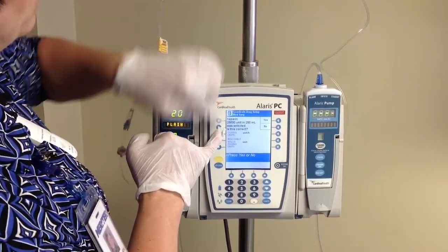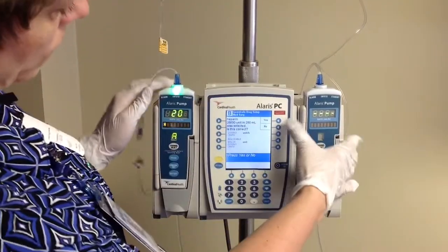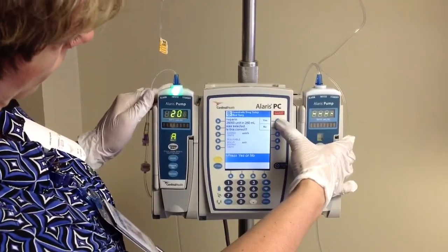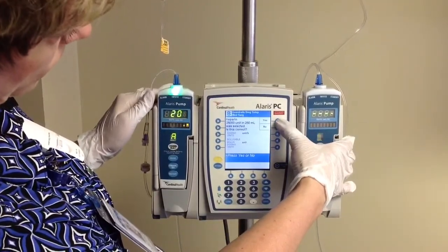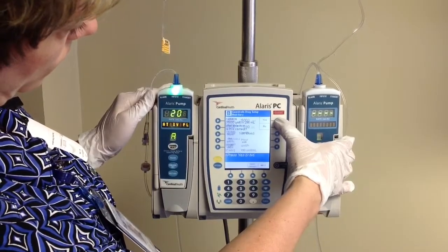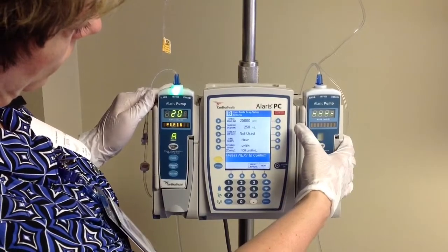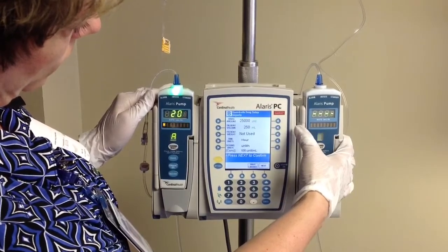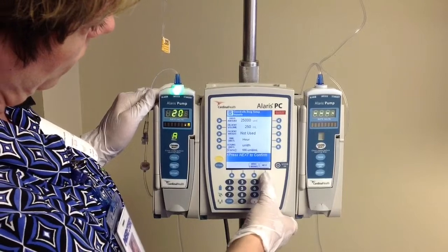We're just confirming that this is the concentration that was on our bag — the 25,000 units in 250 mLs. Hit yes, and then confirm on this next screen.